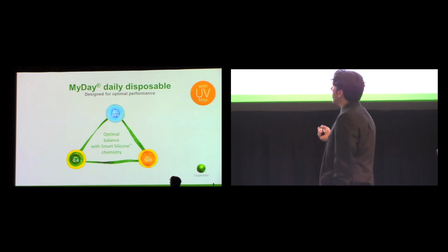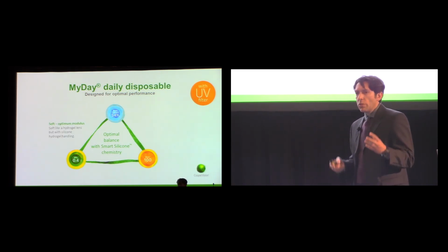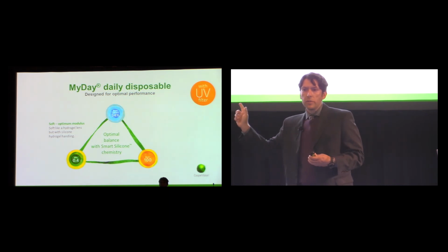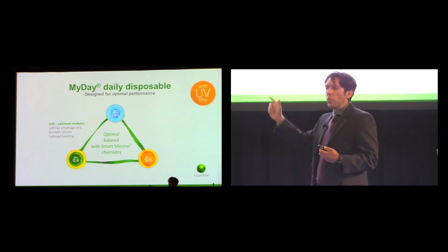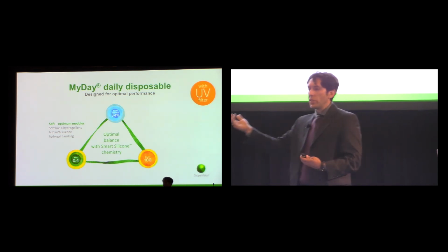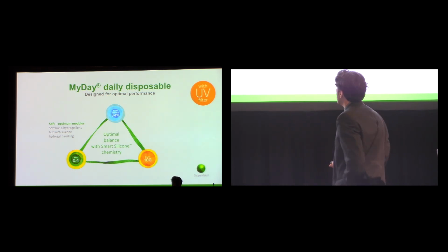And so, as a chemist, I had to look to what material properties I wanted to design the lens around. And so the first thing that we looked at was making an extremely soft silicone hydrogel material. And we thought this was important, and I'll get to it a little bit later in more detail, but it was basically because you had this situation where you had very soft hydrogel materials and much higher modulus or stiffer silicone hydrogel materials. And so we wanted to change that. We wanted to make a soft silicone hydrogel.